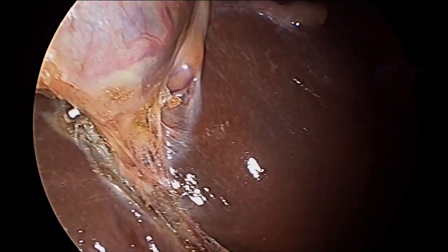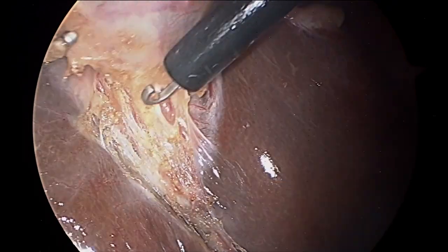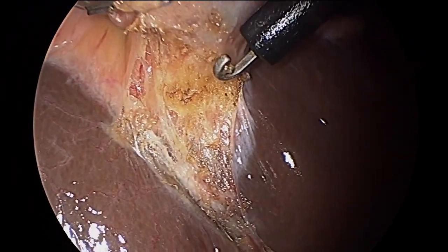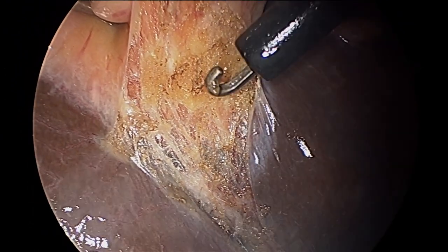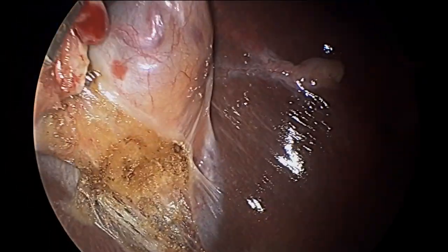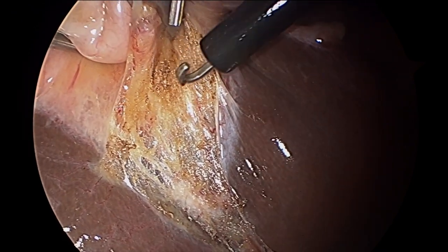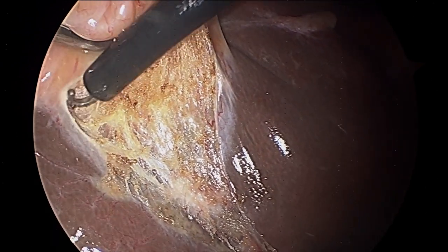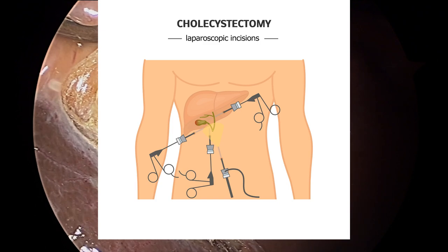Now the gallbladder has to be removed from the liver bed. Here's the hook cautery again — the electricity. There's tension from a grasper that's holding the gallbladder above, out of the view of the screen. This hook cautery sends a little current — you can use it hot like this with heat, or you can use it to push tissue out of the way. The grasper puts tension on the gallbladder between the gallbladder and the liver bed, so that the hook cautery can separate the gallbladder off the liver bed. It's done carefully and meticulously so as not to injure the liver.